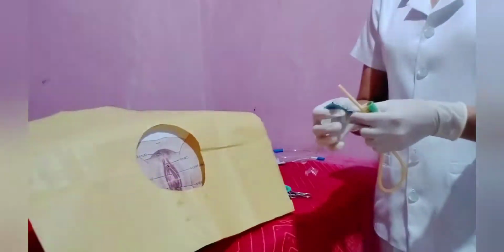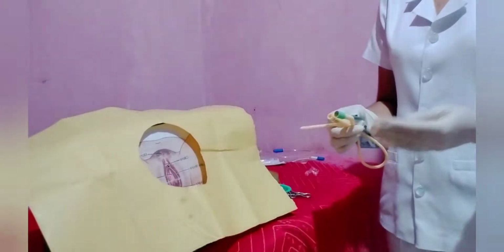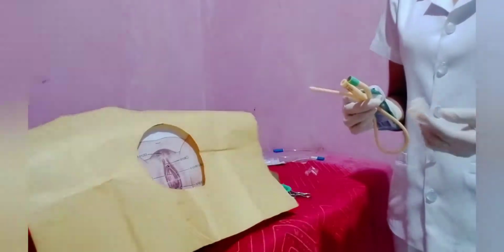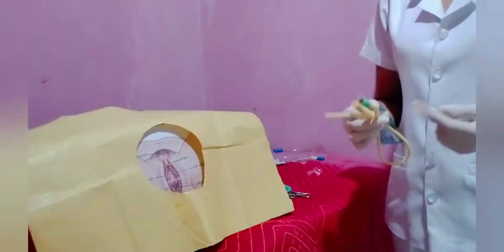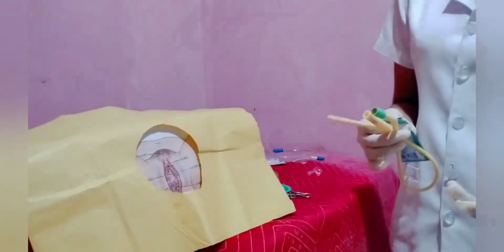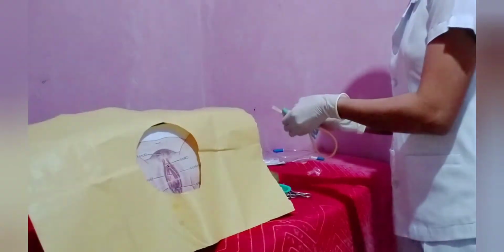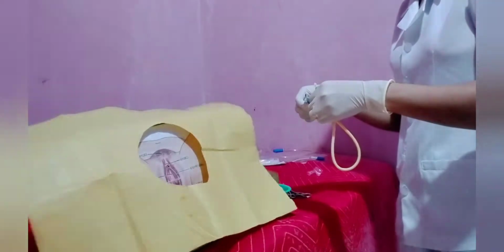Since this is a sterile procedure, we have to maintain sterility. So we just imagine that all of this is sterile. Since we don't have enough equipment, you have to lubricate. Make sure that the tip and eye of the catheter are coated with lubrication to have a smooth insertion and to prevent discomfort. So now I will put lubricant.